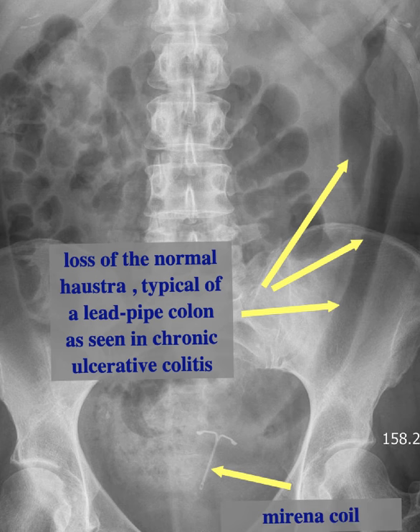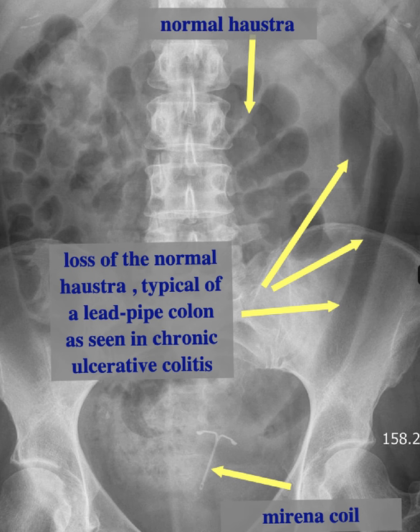Incidentally, you can see a Mirena coil in the pelvis, and you can also see the normal haustra in the more proximal colon, which seems to be spared from the inflammatory process in this patient with chronic colitis of the distal colon.